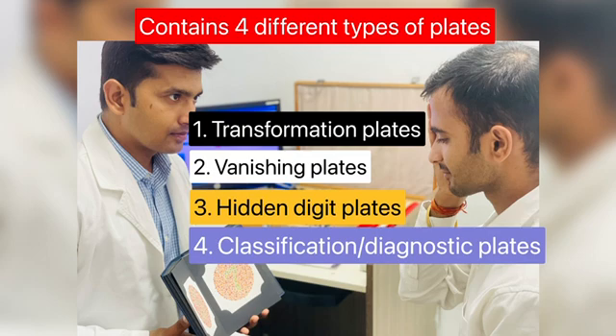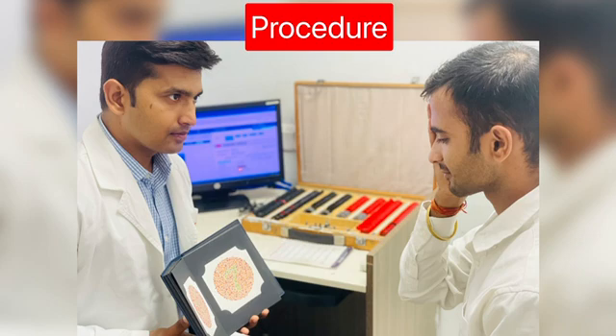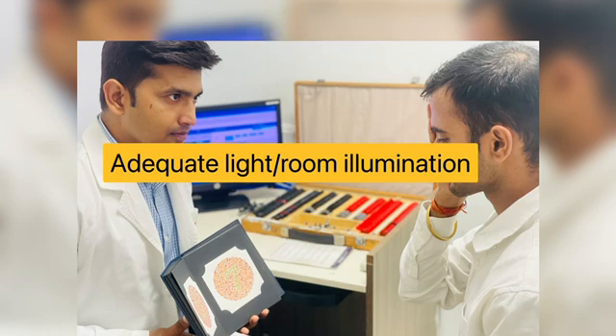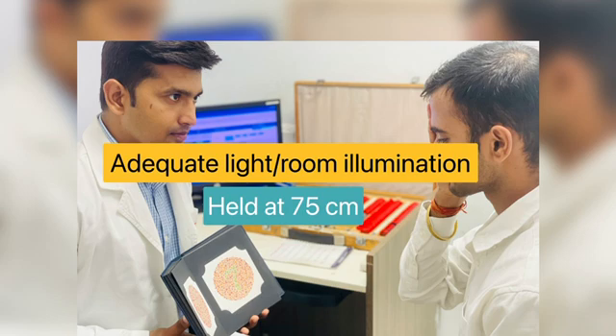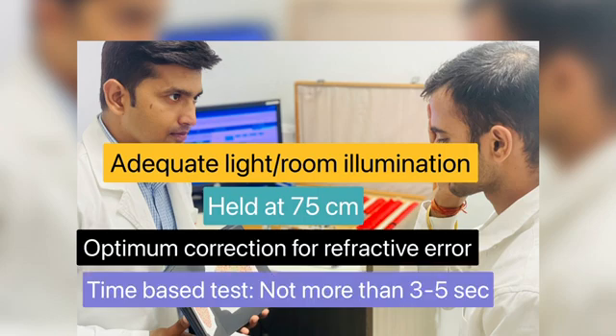The test plates should have adequate light; room illumination is preferred. The plates or charts are held 75 centimeters from the patient and tilted so the plane of paper is at a right angle to the line of vision, as shown in the picture. The patient should wear their optimum correction, and the time given to read each plate should be between three to five seconds only.